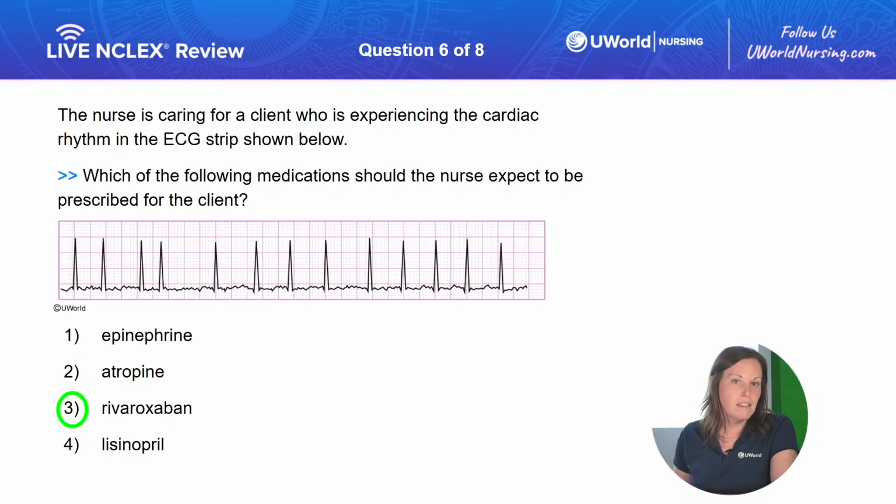So again, the dysrhythmia that we're seeing here is AFib. When we have AFib, we have that slow swirling and pooling of blood in our atrium. One thing about our atrium is we have a little appendage. If you think of your atrium as a pool, the little appendage is like the connected spa. Blood is swirling in there, but it has a high propensity to form a thrombus. If that thrombus were to dislodge, going from stationary to mobile, or embolize, the first place it's likely to go is our brain. So we have a high risk of stroke when we have AFib.